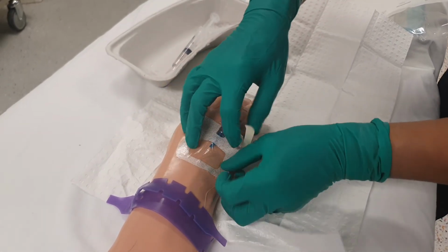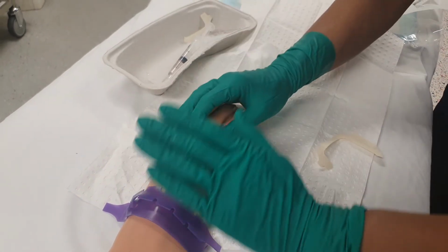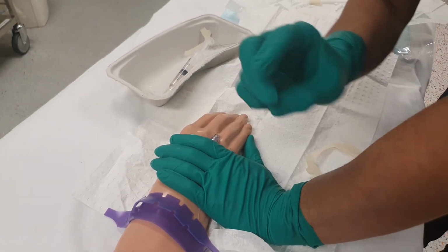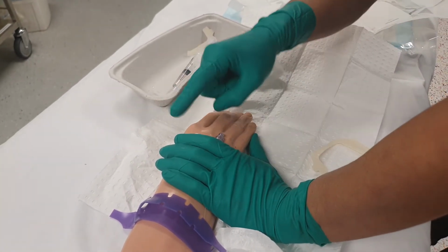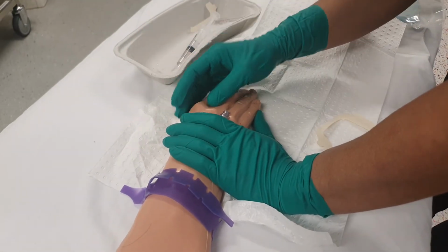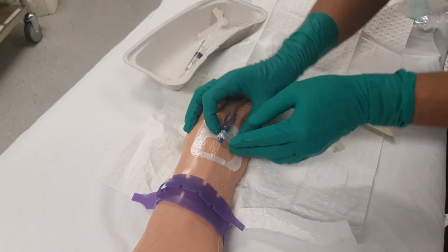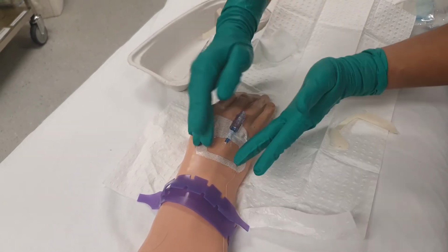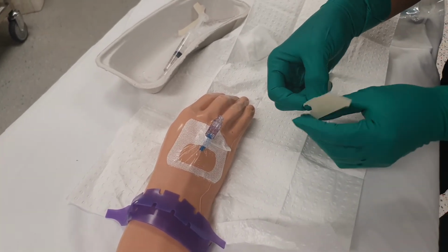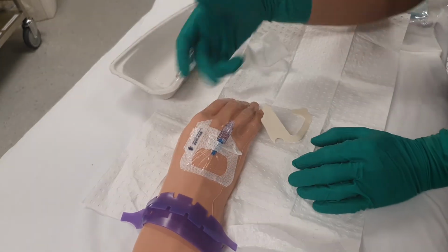All right, so with the occlusive dressings, some of you may have actually seen my other video. The adhesive on the occlusive dressings is activated by two things. One is pressure, and two is the warmth of the patient's skin. This is clearly not a warm patient, okay? But it's really important that you apply some pressure. Okay, there's a little sticker here that we can actually write down the date. I even like to write down the time.